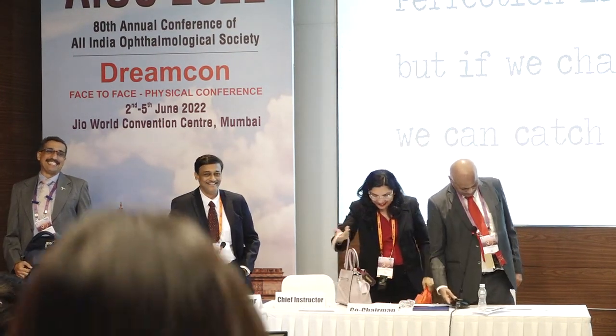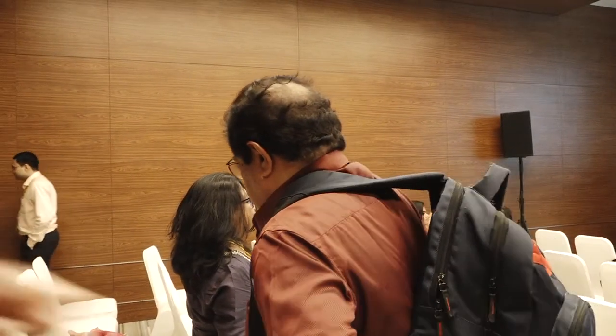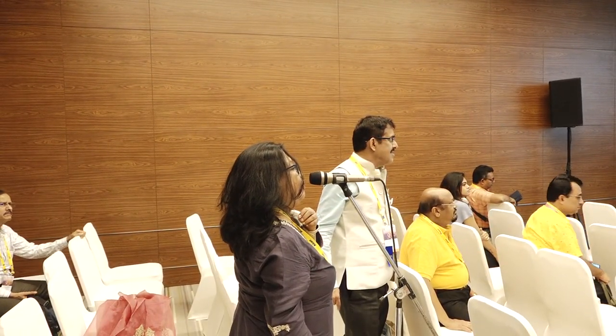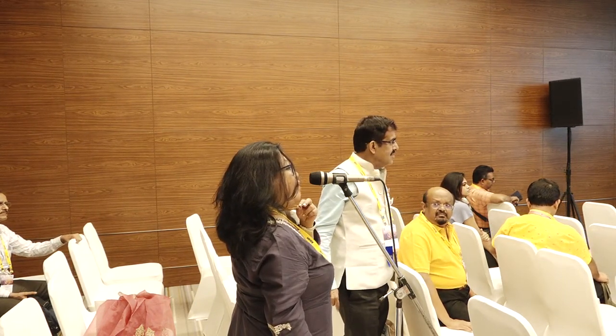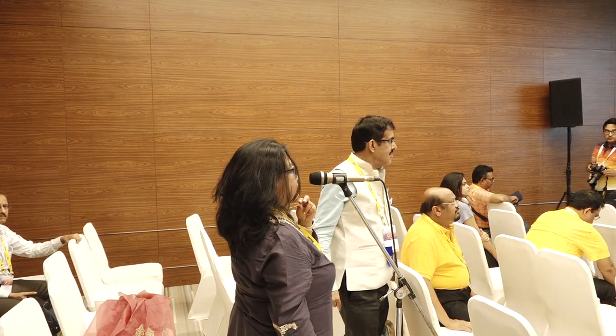No problem. I wanted to ask one question. Sir, if I have a patient with a very hard cataract and a pre-existing cylinder of maybe more than 3 at 90, and he cannot afford a toric lens, and I am not confident with temporal SICS, so what should I do?